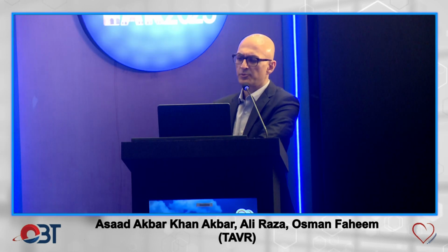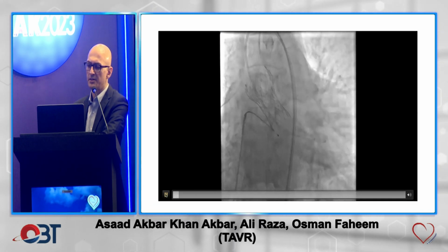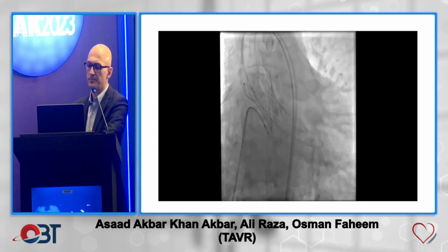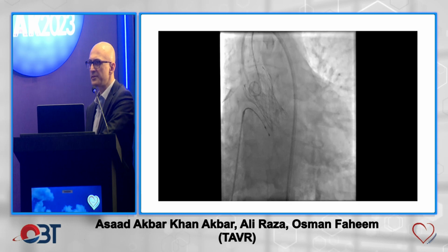And sometimes if you can't pull the pigtail back, I just wire it out. It's never been a huge issue. So we were left with mild PVL in this case, and we decided not to post-dilate. The patient was stable, and the post-hemodynamics didn't suggest significant AI, so we left it at that.